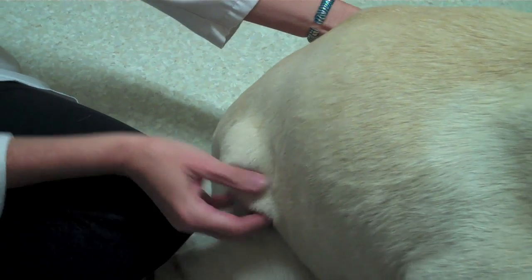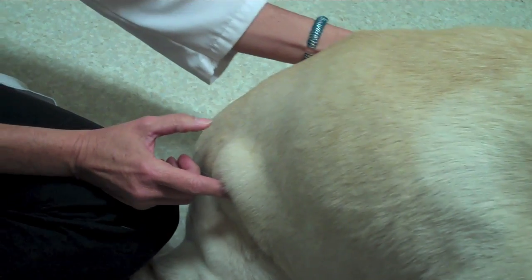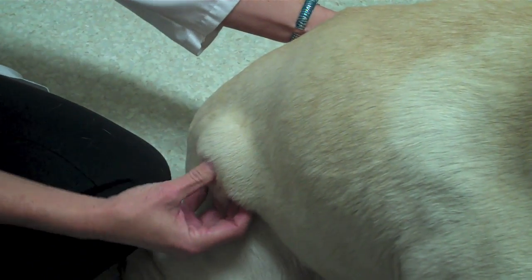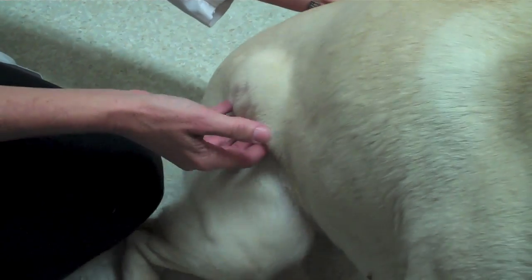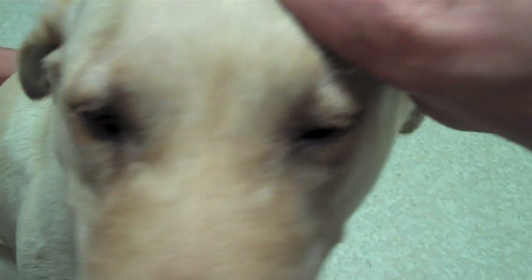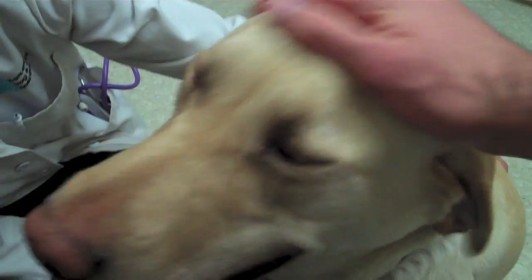So what I'd like to do is just clip a little bit of this fur and then pop a needle in there and see what kind of fluid we get out, okay? That could be that he's developing a little abscess there. If he had a scratch or the tip of a plant or a thorn that broke off in there, something like that can certainly cause this type of lump, okay? So let's take a little sample of that and see what we have inside, and then that'll help us decide what we're going to do with it, okay? Is that okay, Rocky? Okay.